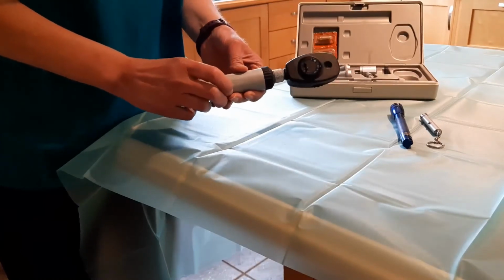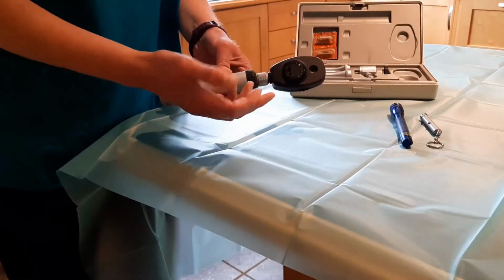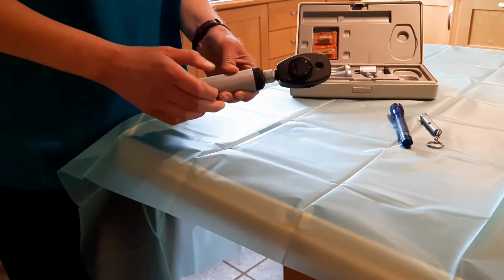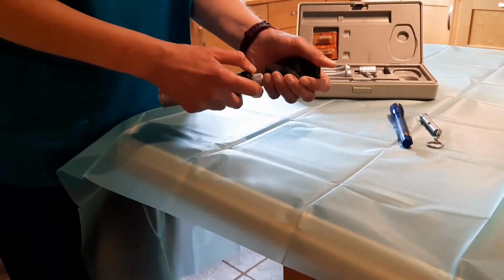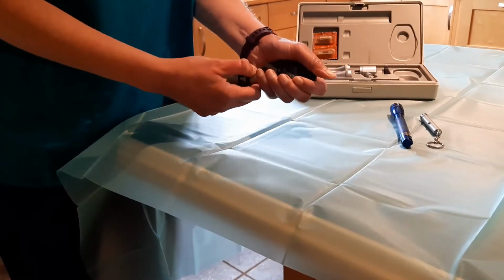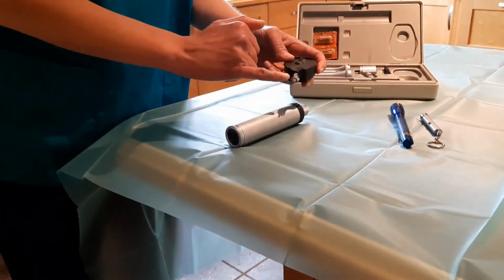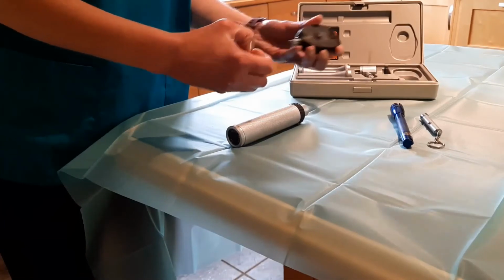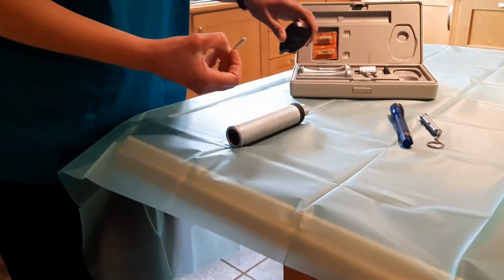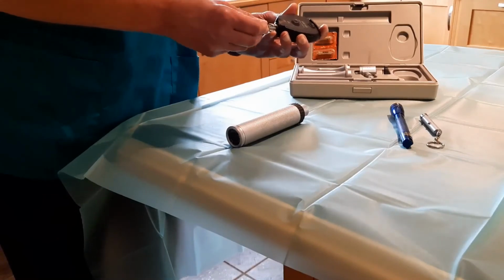Models vary a little bit, but you can sometimes adapt the beam of light to being a half beam or a blue light filter, and that can help with the diagnosis of various eye conditions. To remove, just rotate at the neck and pull out the ophthalmoscope head. This is the bulb, so if it's not working and the batteries are okay, then we can remove the bulb, put a new one in, and see does that sort out the problem.